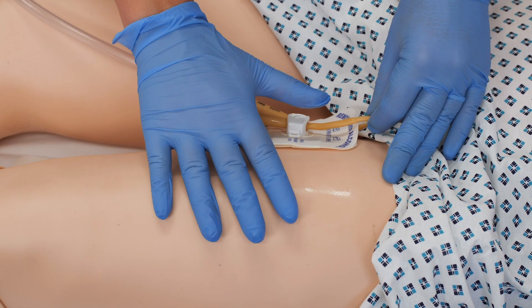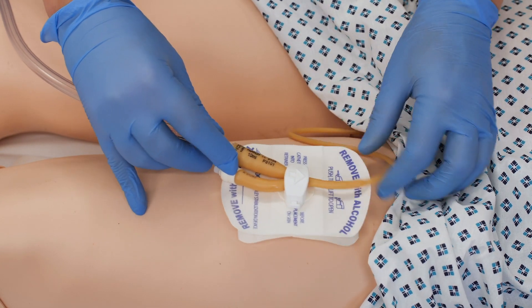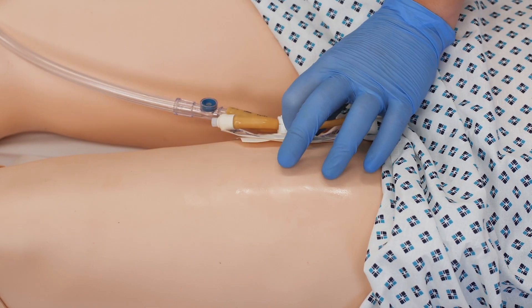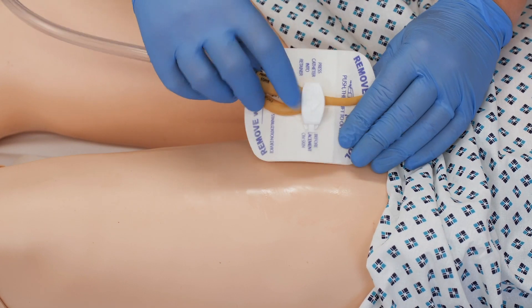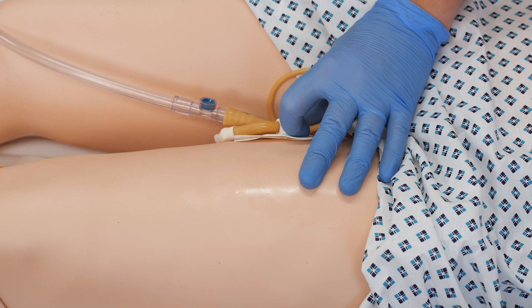We're going to let that dry. The reason why we put it on top of the leg on the inner side is because there's a risk of this causing pressure damage if the patient's legs were to come together.